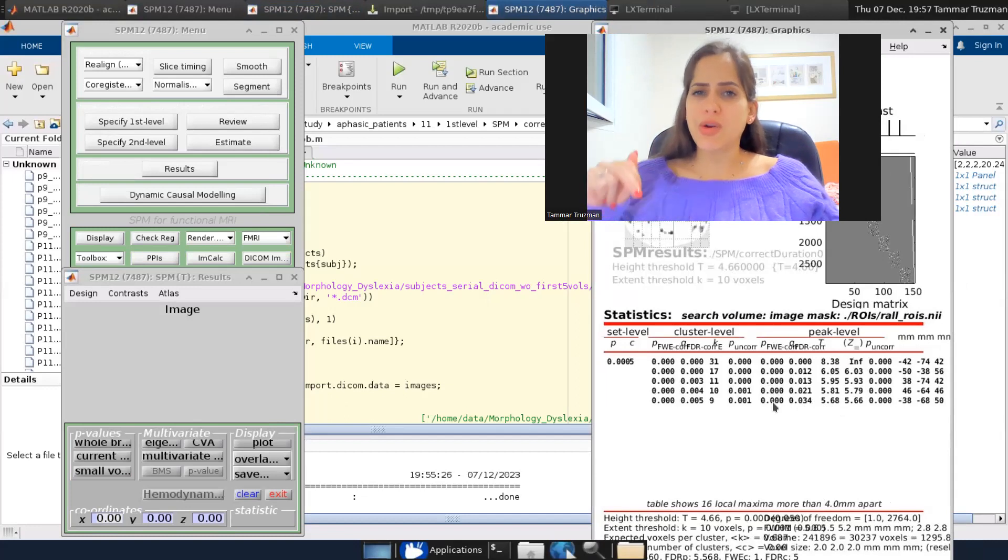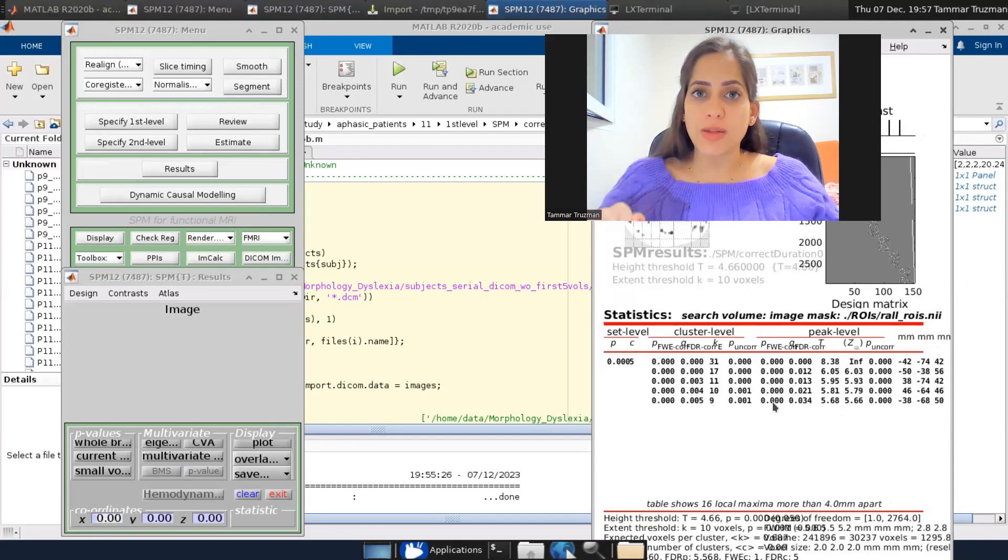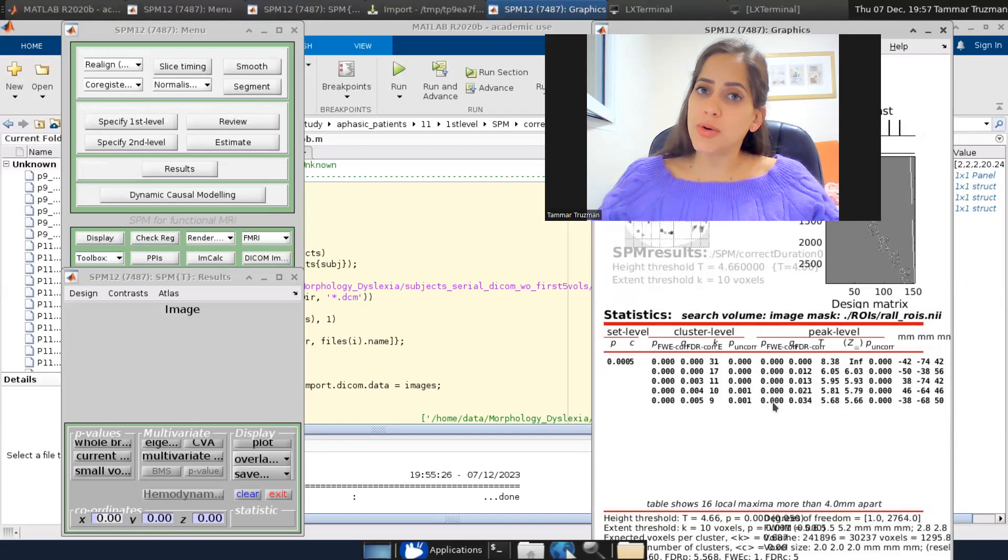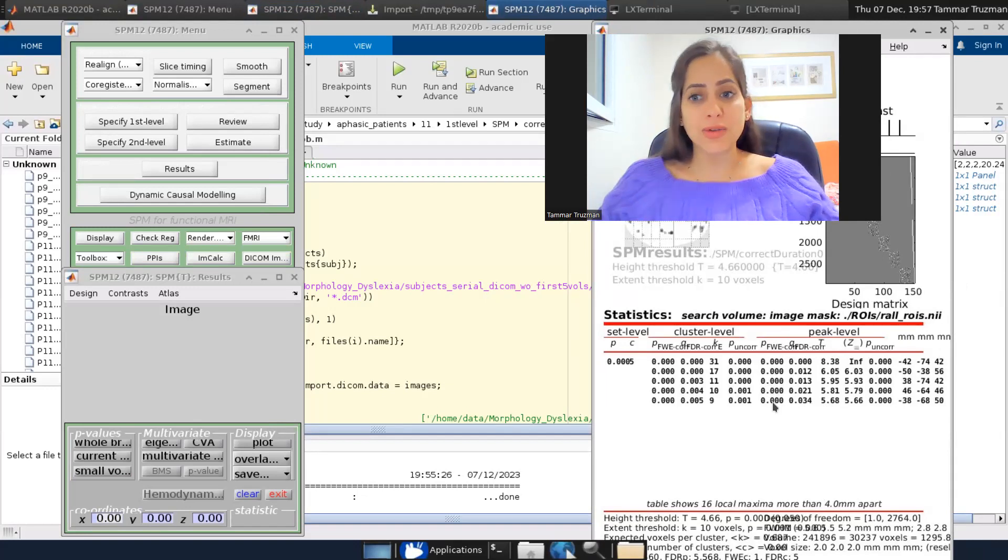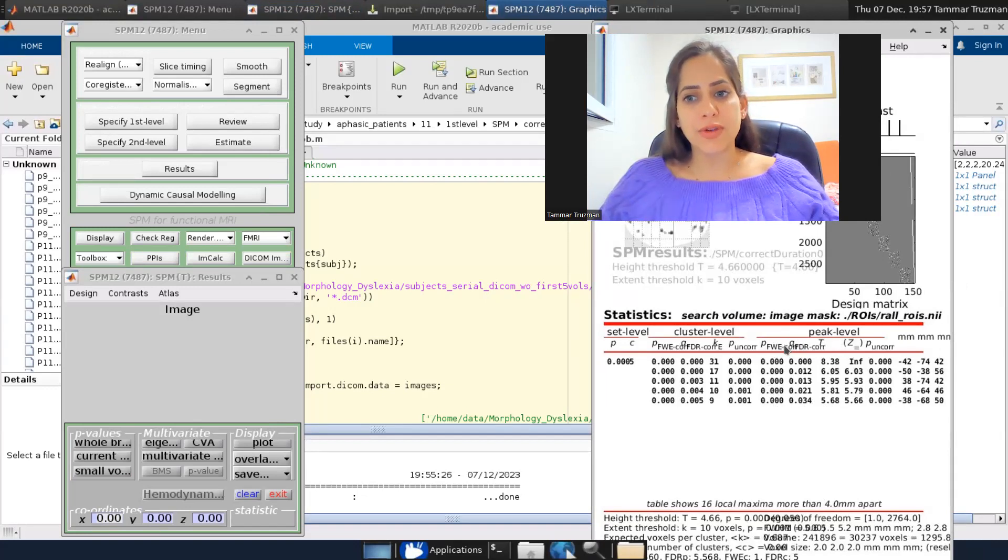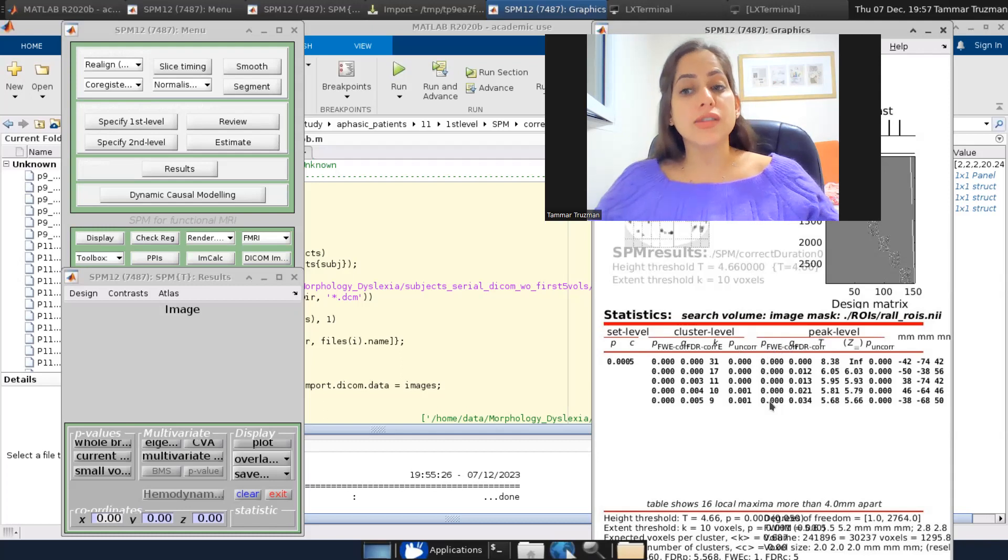but it was for all the voxels in the brain. And now I corrected only for the voxels within my VOI, which makes it more liberal. Therefore, my p values under the peak level family-wise error p are smaller than before.